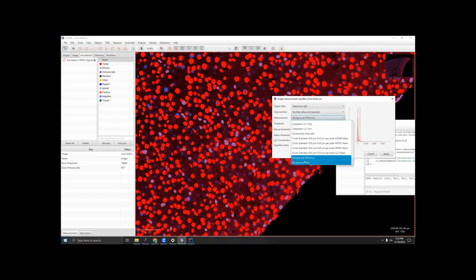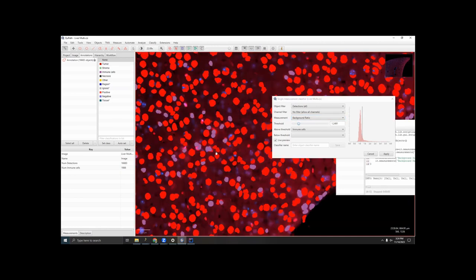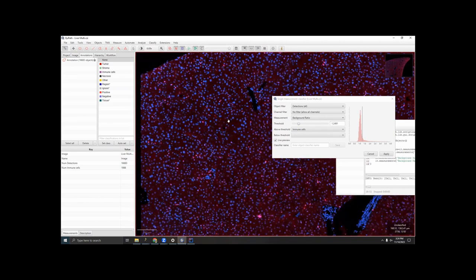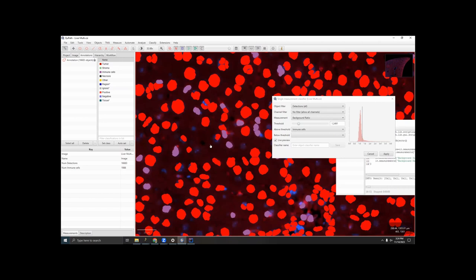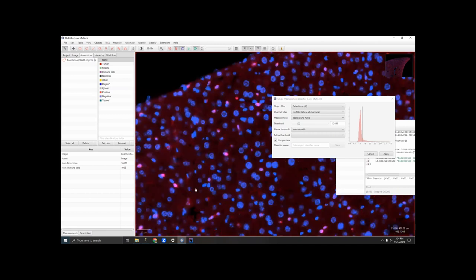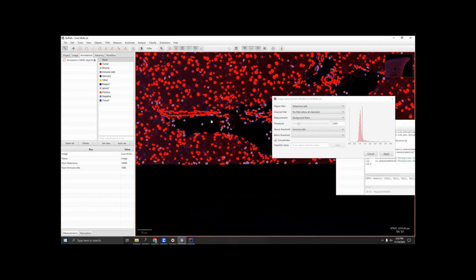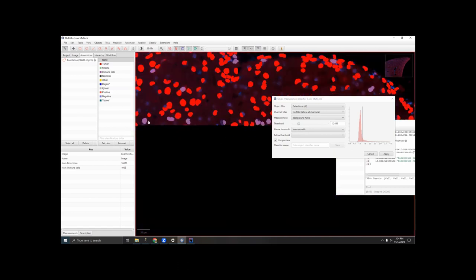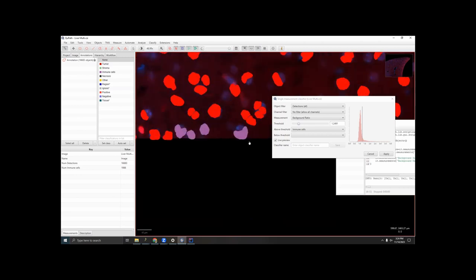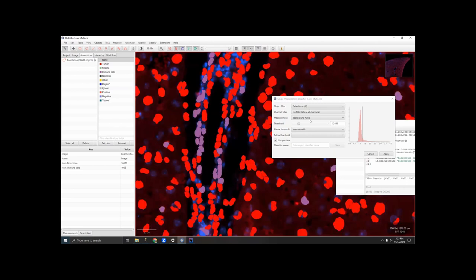And just for completeness, let's look at the background ratio. Let's adjust that a little. Find a good spot. How does this look? Actually, that looks pretty good. Both background difference and background ratio seem to be improving the accuracy of the classifier. This bottom portion also has some of the false positives because it collected some like true zeros as part of the background. That's interesting.